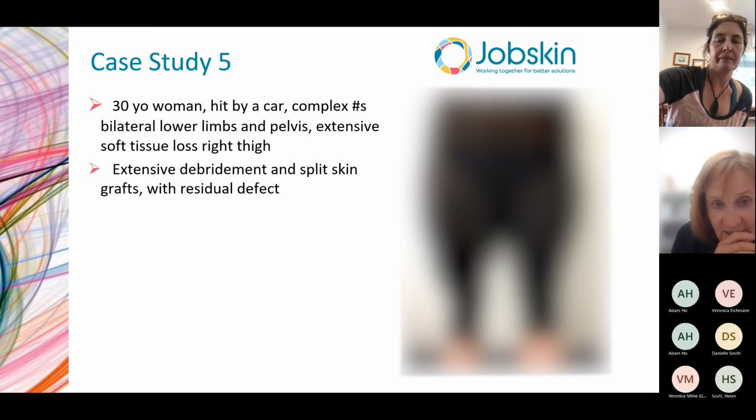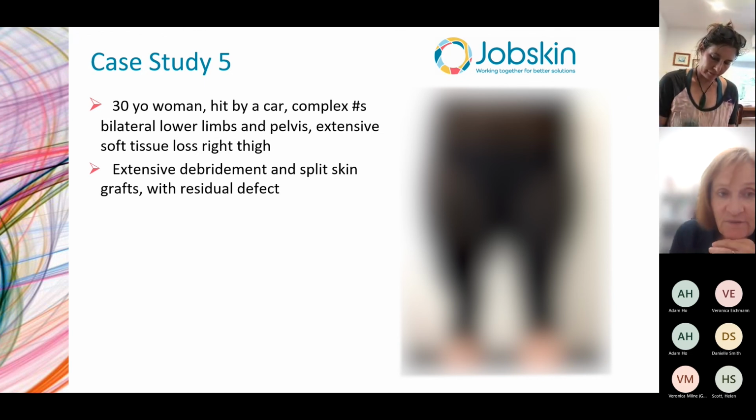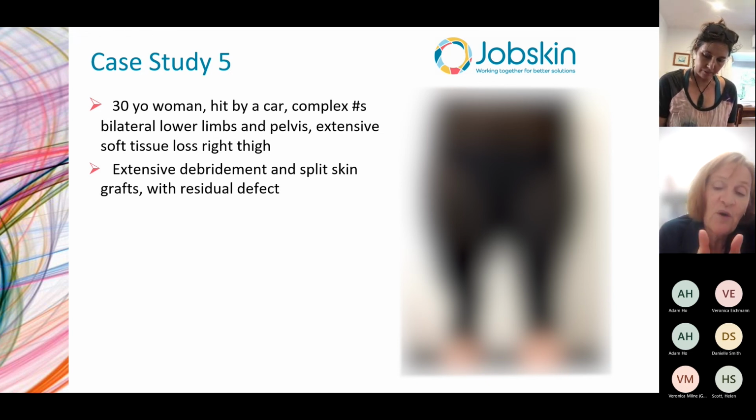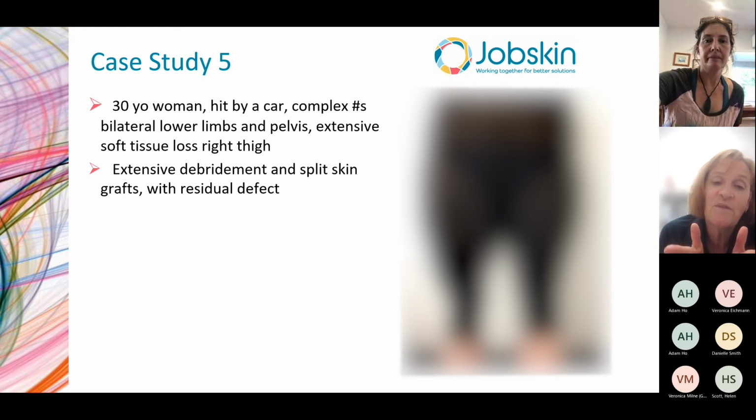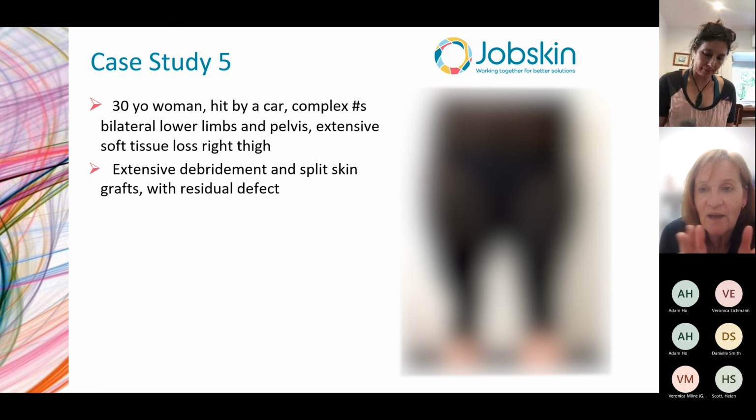And she wore these capri pants for a considerable period of time. Now, what you're achieving when you've got a memory foam insert is that you then get this transfer of the compression through the memory foam onto the scarring that needs it. Because if you don't fill up that defect, you'll get compression everywhere except on the skin grafts. And everywhere is not bad in terms of managing edema and helping with some tissue shaping around the defect.